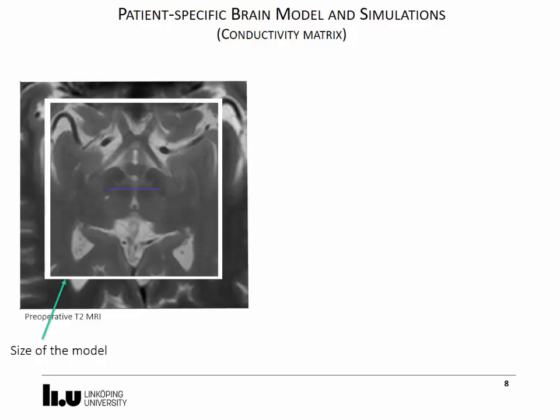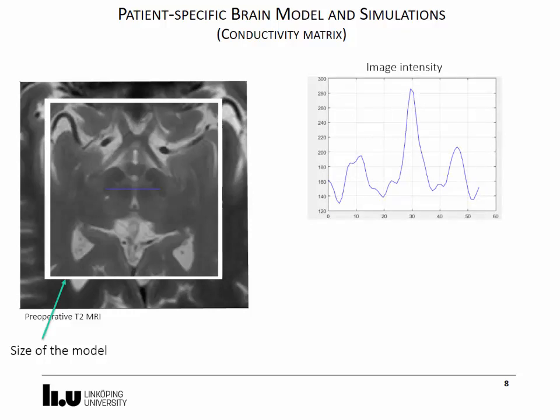The MR images are then segmented based on the image intensities. The user may draw a line as the blue one shown in the image to display the intensity values along it or draw an ellipse to obtain an average intensity value inside it.